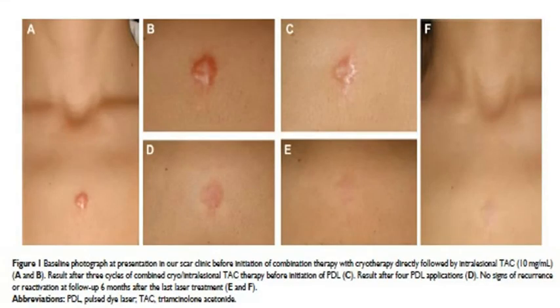Treatment of hypertrophic scars and keloids. Intralesional corticosteroid injections and cryotherapy.